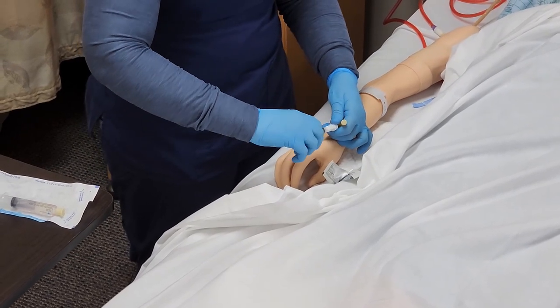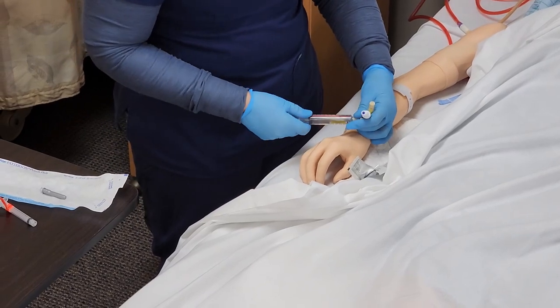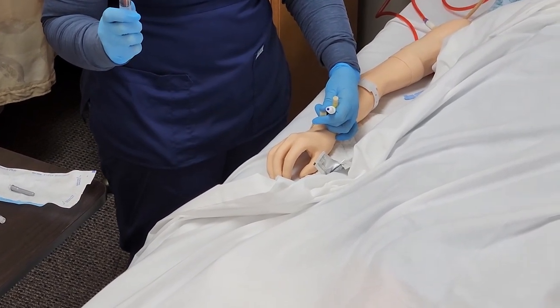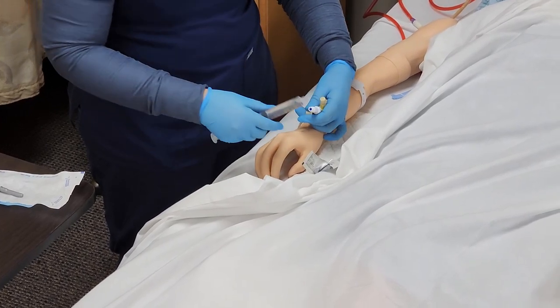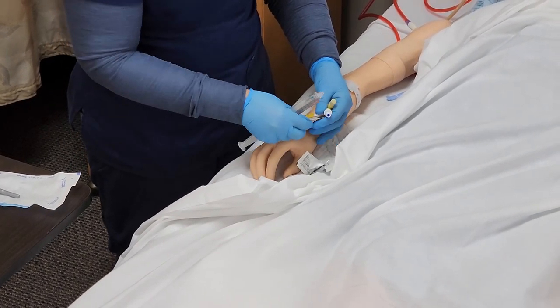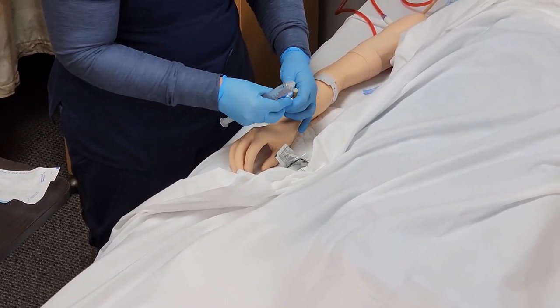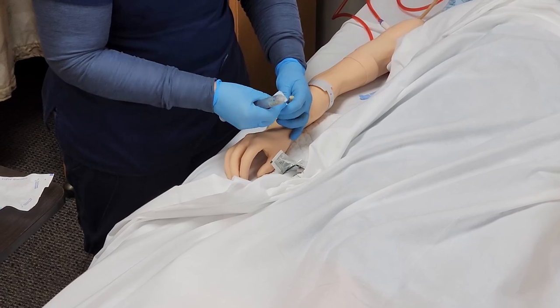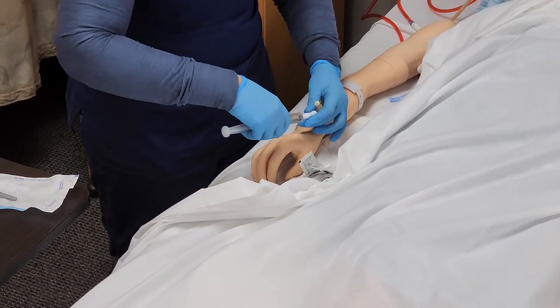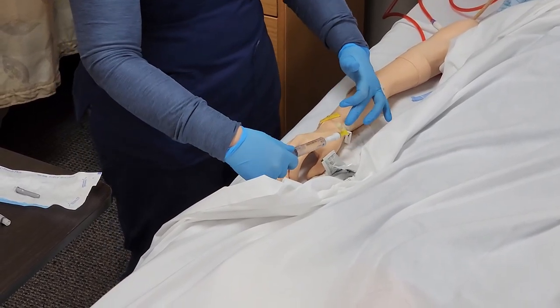I'm going to clamp and remove the syringe. I'm going to apply another flush to make sure that all of my medication is getting into the patient — so that anything left in the tubing is pushed into the patient. I'm going to flush at the same rate as the medication I gave, so that I'm not giving a quick bolus of medication that might be left in the tubing.